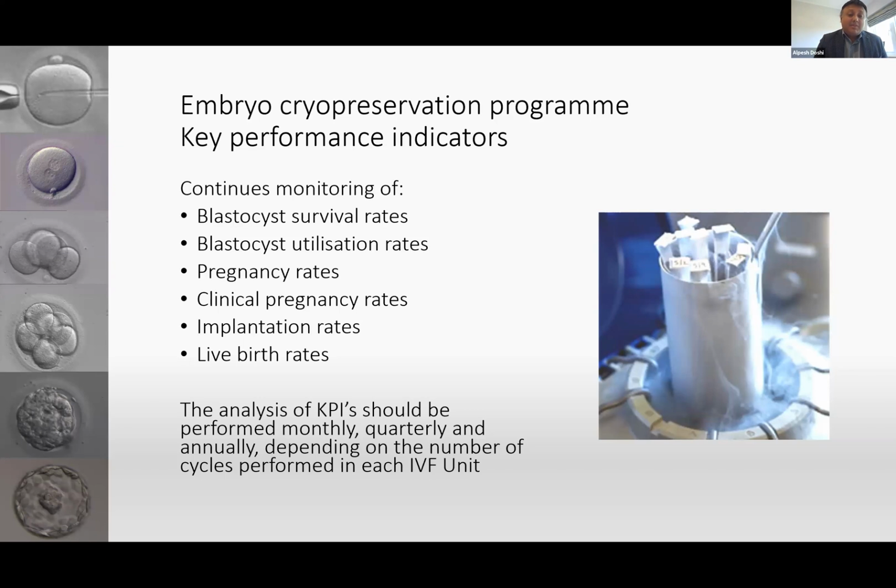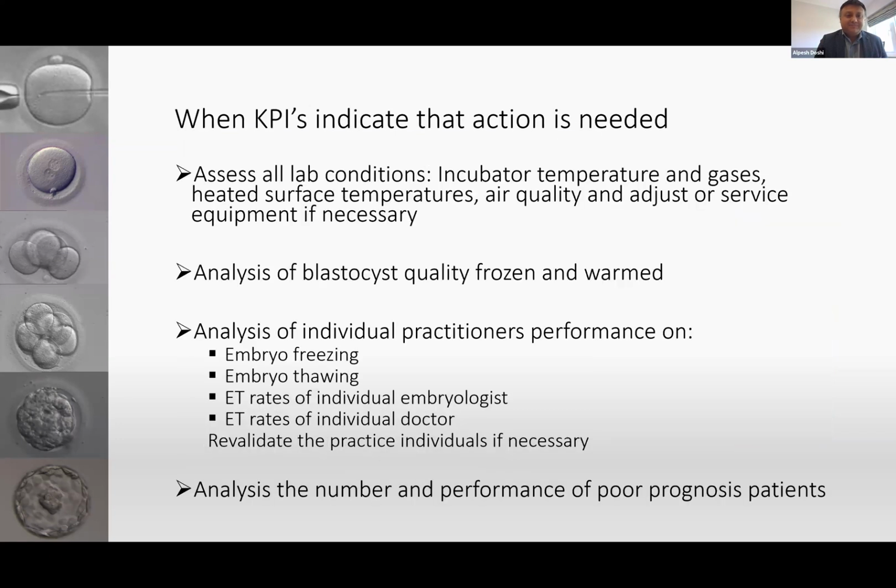I'm not sure how things are working abroad, but in the UK, a lot of the clinics are performing almost 80% frozen embryo transfer cycles. And I'm sure this is the case globally as well. So it is quite important that embryologists perfect the whole skill of vitrification and warming, simply because there is a move towards more and more cycles ending up with cryopreservation and frozen embryo transfer.